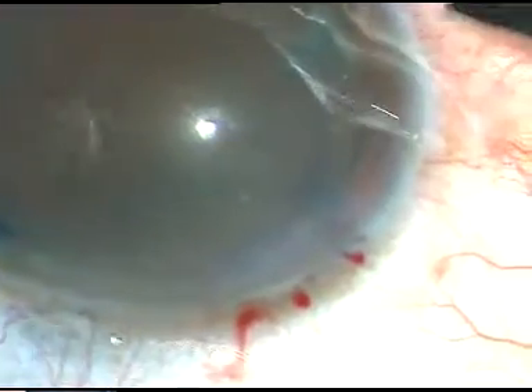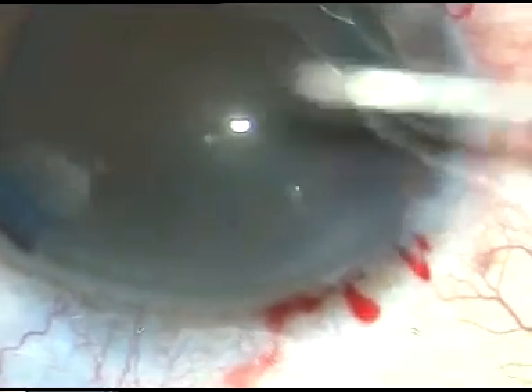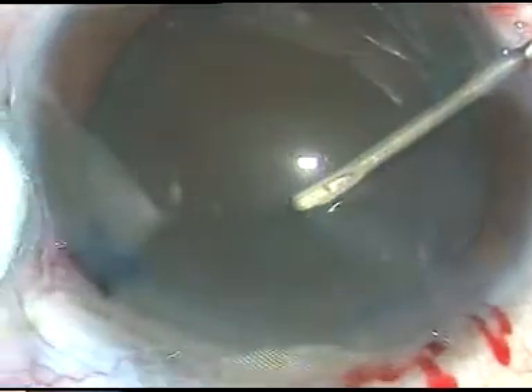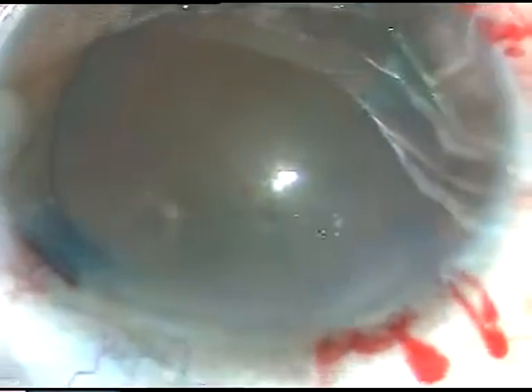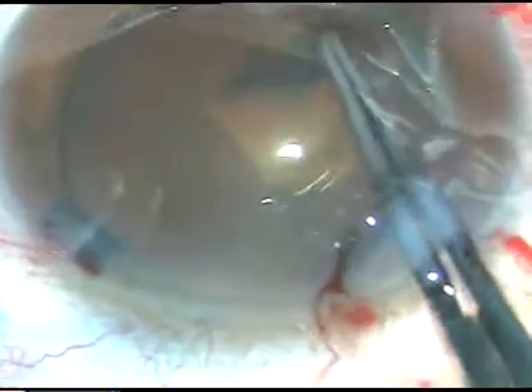Dear colleagues, in this video I am going to demonstrate woodcutter's technique of management of the hard nucleus in three phaco surgeries. I am going to show capsulorexis also in all the three cases. The capsule has been stained with trypan blue dye so that the rexis becomes nicely visible.